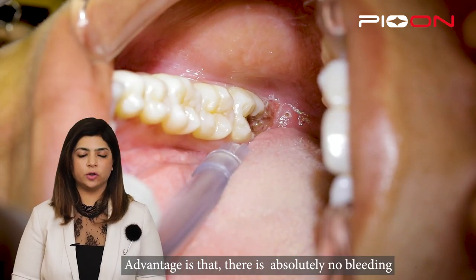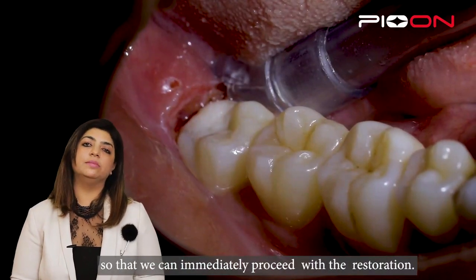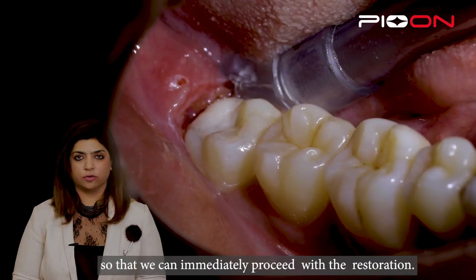The advantage here is there is absolutely no bleeding, so we can immediately follow it with a restoration.